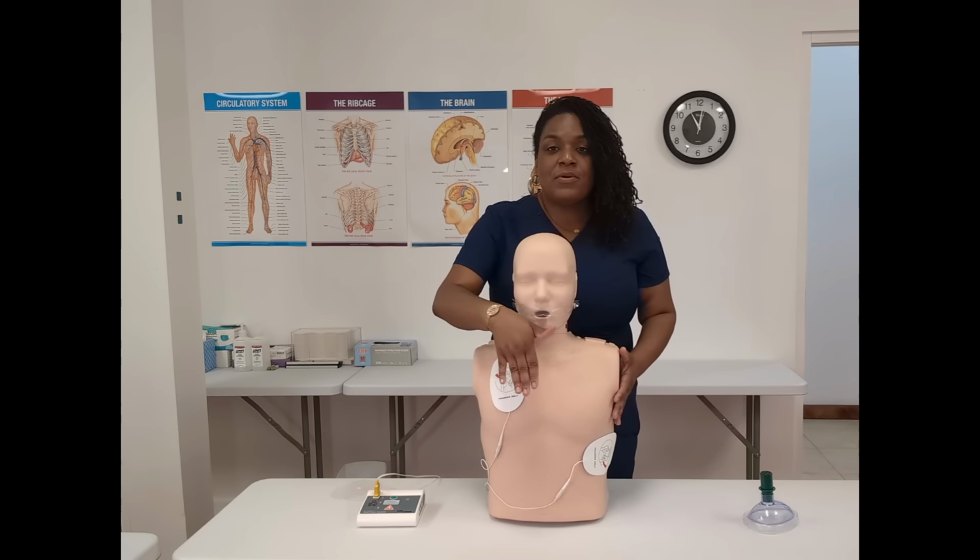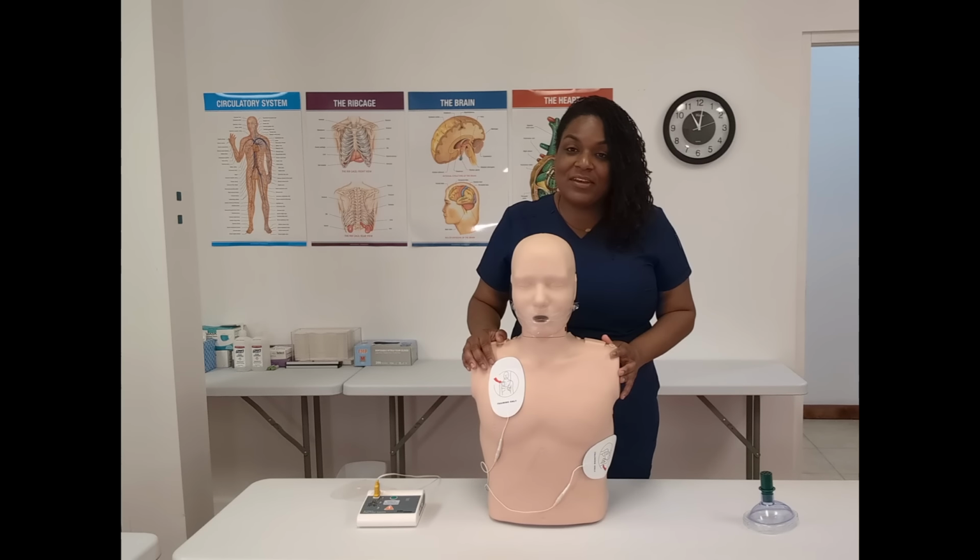If that's the case, you put one pad on the center front of the chest and one pad in the back. When in doubt, who's on the phone with you? That is right, 911. You have the dispatcher. They're going to work with you and they're going to make sure that they are helping you to help save this person's life.